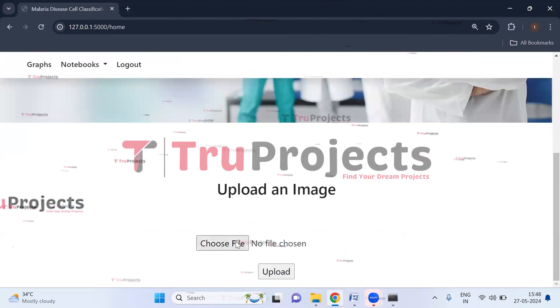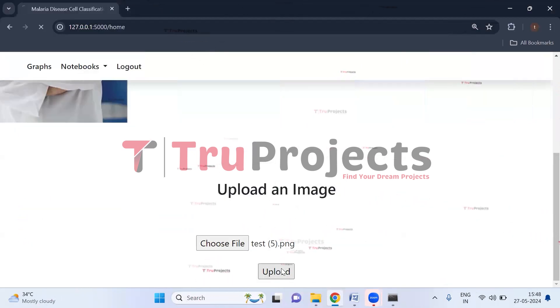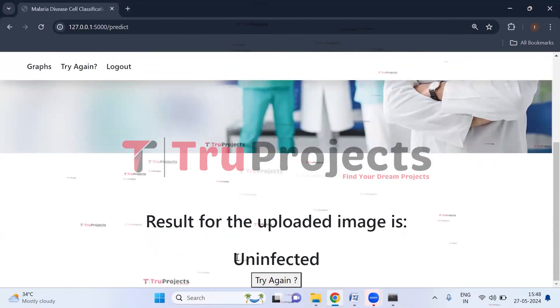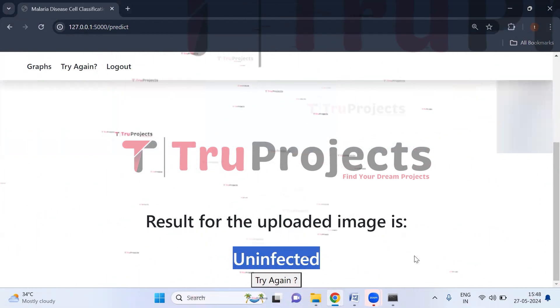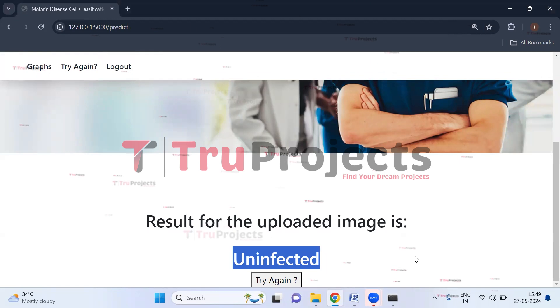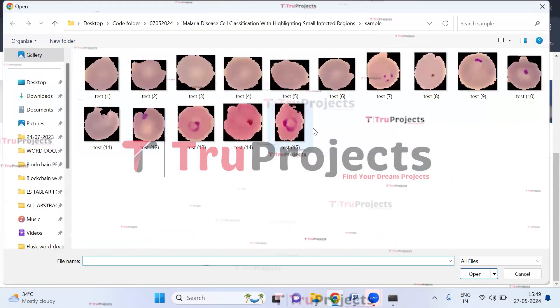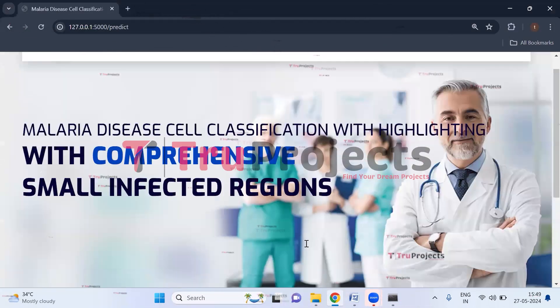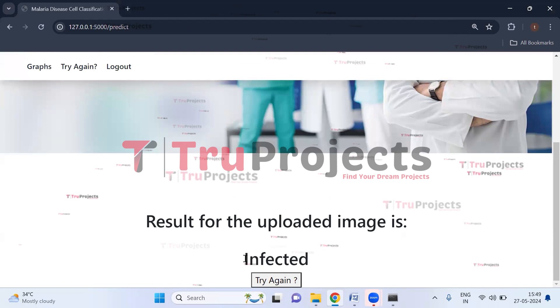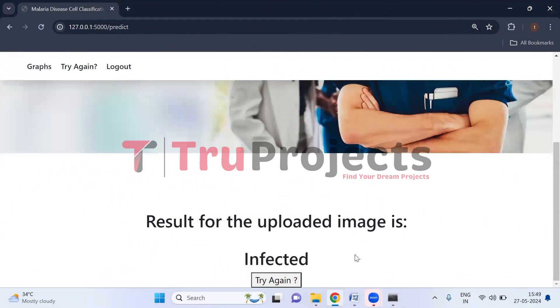Let us upload some more images. Selecting another image and clicking Upload, the result shows 'uninfected,' meaning it is a healthy cell not infected with malaria. Uploading yet another image, the result shows 'infected,' meaning the person is infected with malaria.